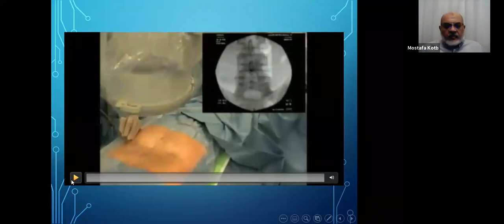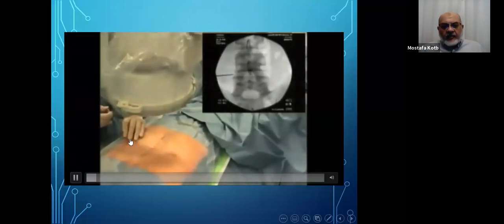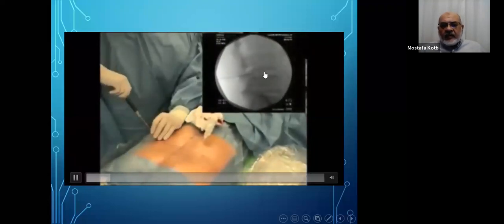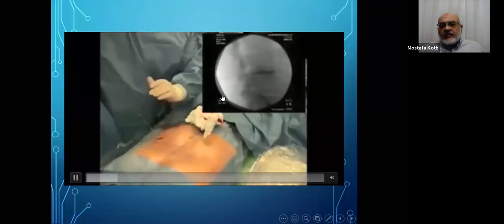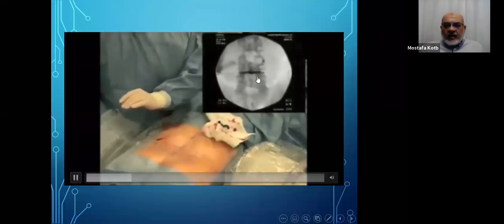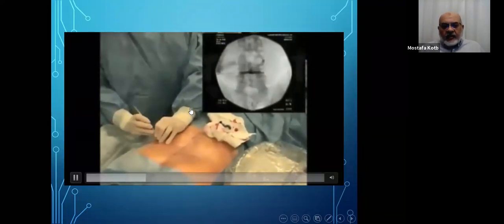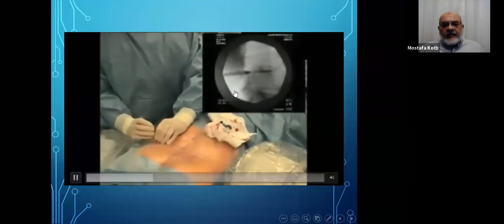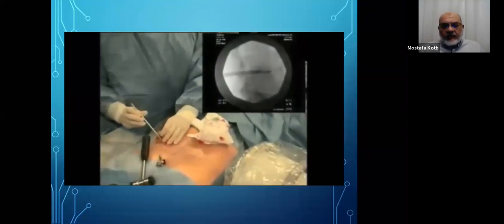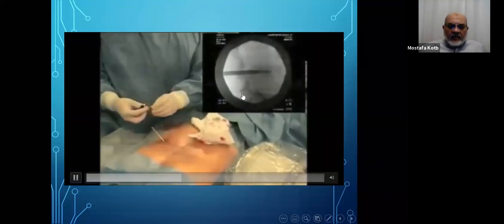In this video, I'll show what we used to do by that time. You go through this approach under fluoroscopic guidance to the angle, and you proceed to the center of the disc. Then you start injecting a dye to do discography to verify the level and to verify the symptoms are related to this level. You then start introducing the dilators over the guide wire and the trephine to widen the foramen, if you need to, to reach the posterolateral angle comfortably.